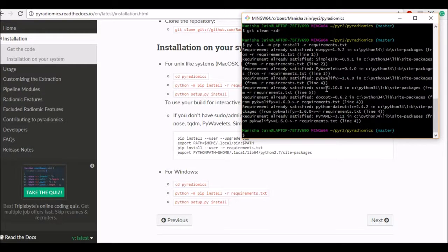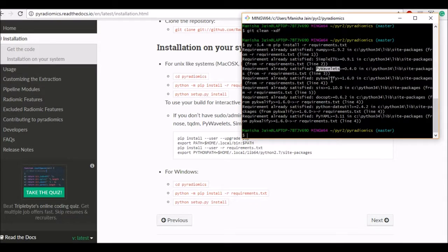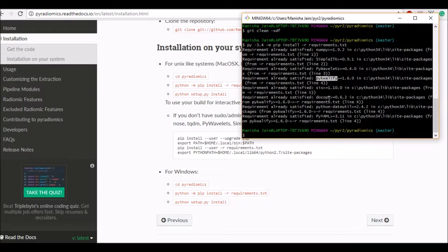So it came back and voila like we have been able to install it. So it has installed numpy, simpleitk, pywavelets, pykwalify and other files pyyaml etc. So this all looks good.